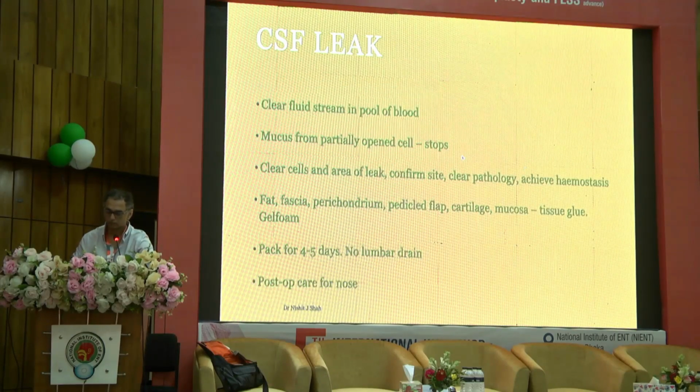When do you suspect a CSF leak? Typically, you get a clear fluid stream in a pool of blood. So there's been blood and suddenly you see water running through it. It can sometimes happen from mucus or serous discharge, but that will stop. That's limited. A CSF leak will not stop, it will continue. What you have to do, clear the area around it, get hemostasis. Without hemostasis, you will never be able to see where your CSF leak is from. And then locate the site of leak and repair it.